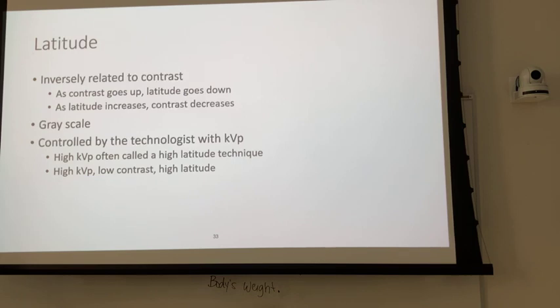Can you? Yeah. Are you going to get penetration through the patient? Yeah. Is it going to be ugly? Yeah. Should you ever? No. But can you? And the answer is yes. Okay, so you have a lot more latitude the higher the KVP goes up.